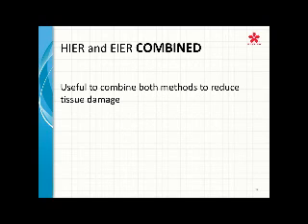So sometimes you'll see heat and enzyme combined, and this way it minimizes the damage that happens from the enzyme. Usually how it works is the heat is performed first, followed by a rinse, and then the enzyme is applied for a short time. This combined epitope retrieval is less common. You don't see it used so much in the laboratory. Generally you're going to see heat-induced or enzyme-induced.